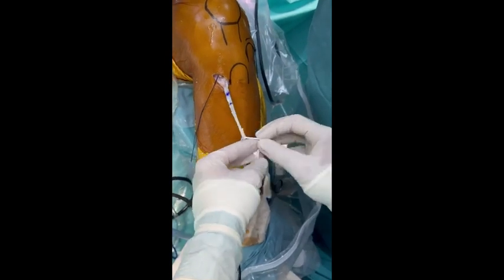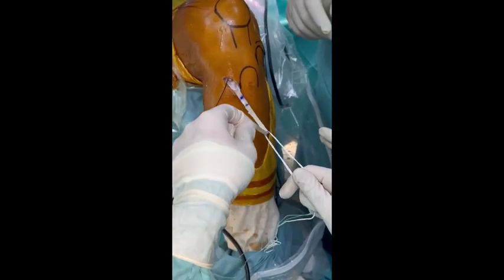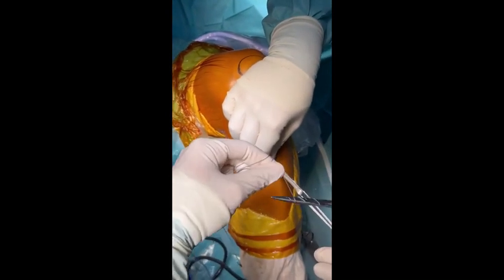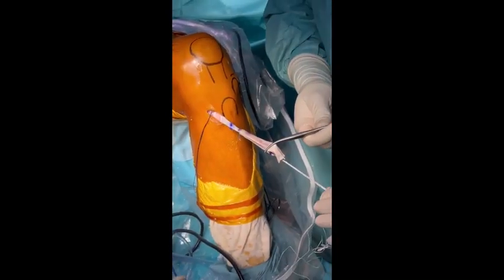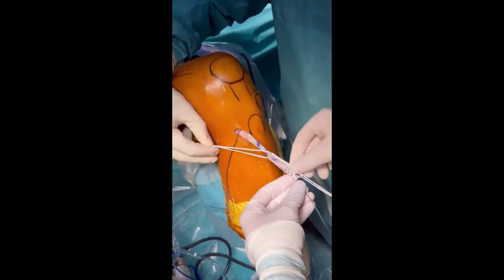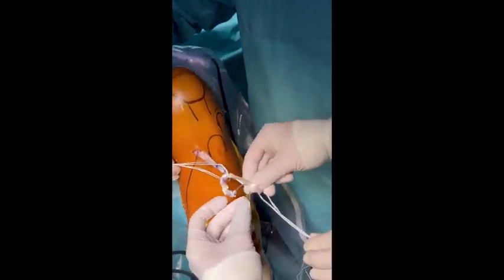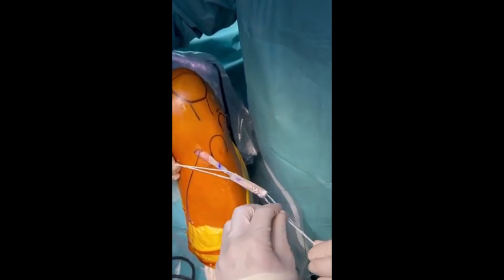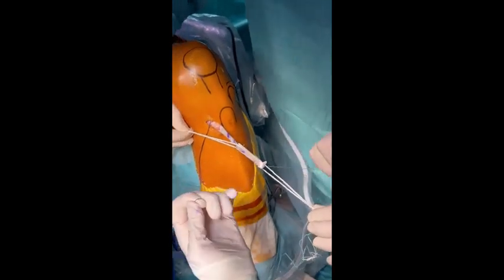The graft is folded over the femoral button and is stitched over itself. The free end is passed through the tibial cortical button and is symmetrically folded again, and excess tendon is excised. The free end of the semitendinosus is stitched, and both free ends of the suture are tied together over the femoral button and over the graft itself with 4 knots.